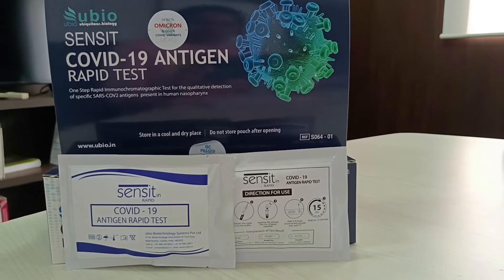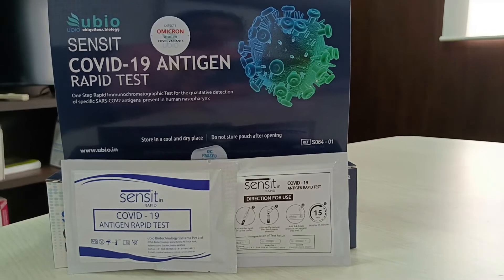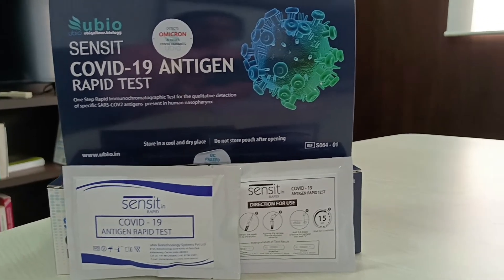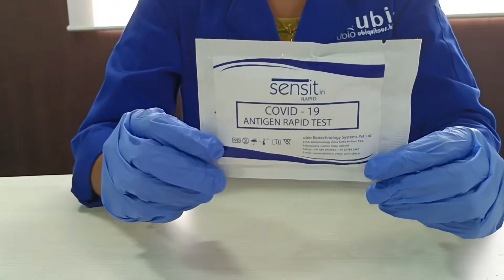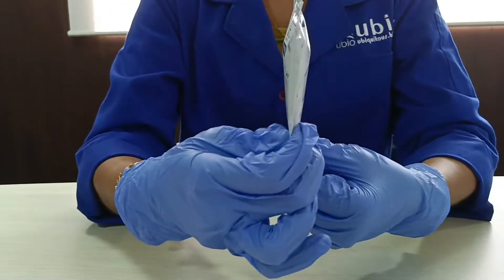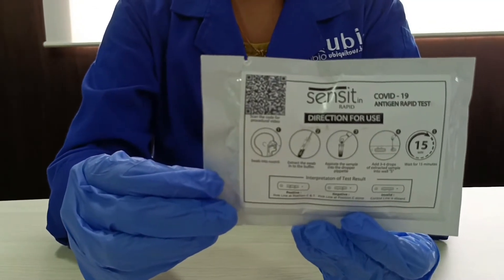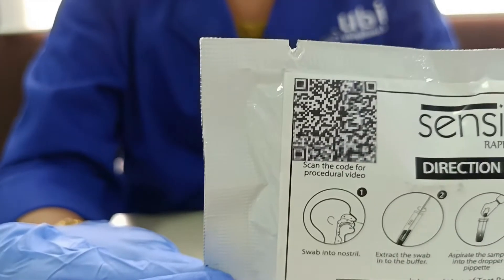Hello everyone. This is the procedural video for SENSIT COVID-19 antigen rapid test for self use. The direction for use is detailed on the backside of the pouch. Scan the QR code for detailed procedural instruction.